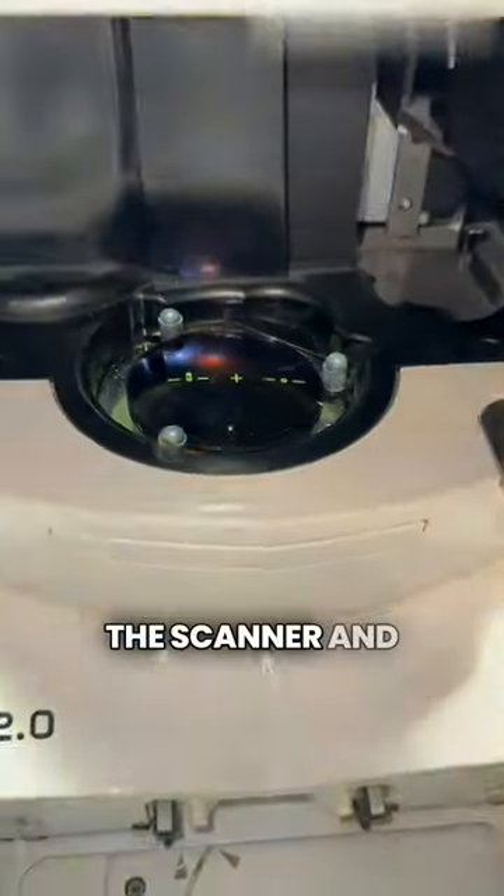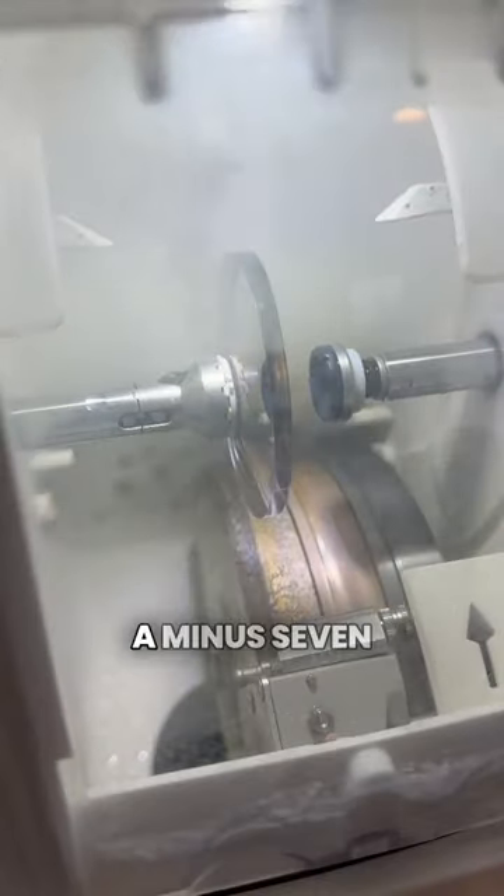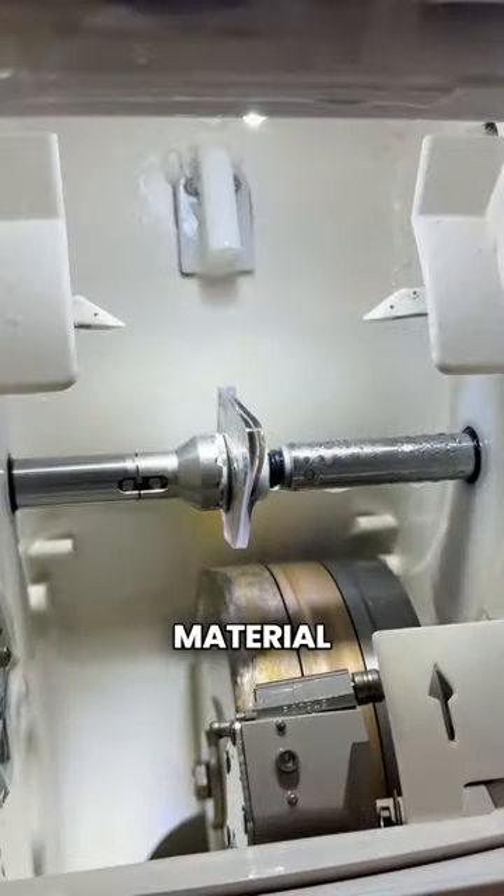Now the lens gets blocked by the scanner and into the cutting machine. As mentioned, these lenses are a minus seven prescription and they came out super thin. They were done at a 1.74, which is the thinnest lens material possible.